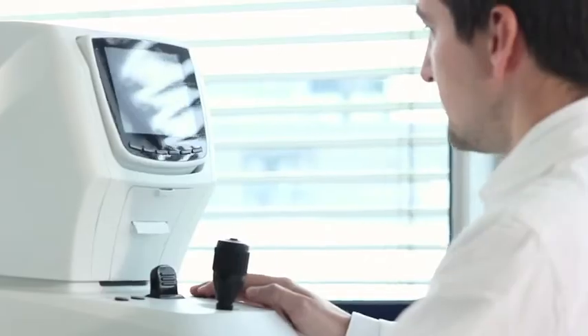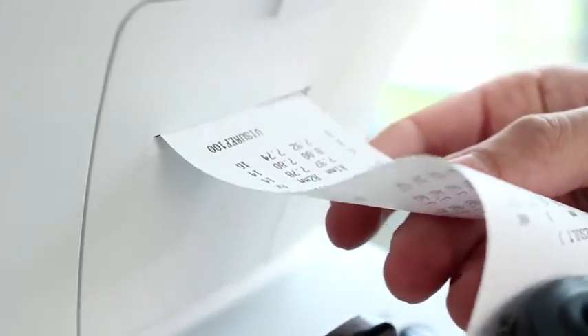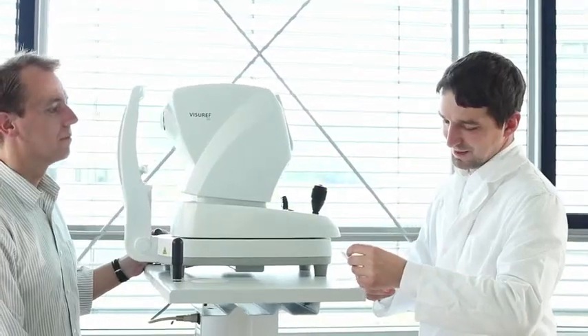Pushing the printer button produces a ticket. You can also transmit the results using the integrated serial interface. Performing objective refraction with confidence, the Zeiss Viseref 100 is a highly accurate and easy-to-use instrument that fits easily into your workflow.